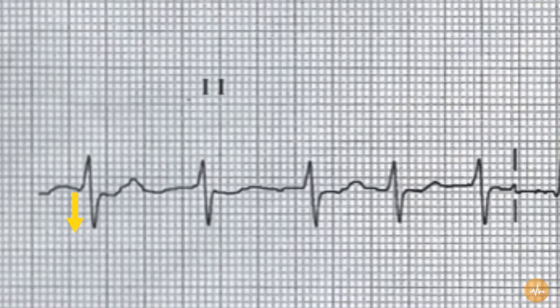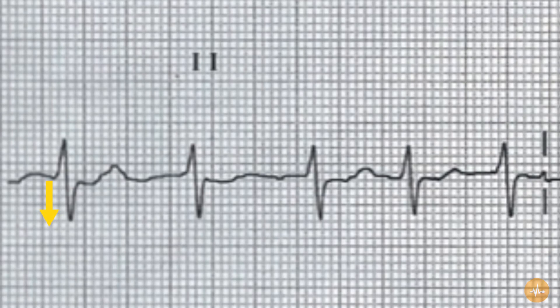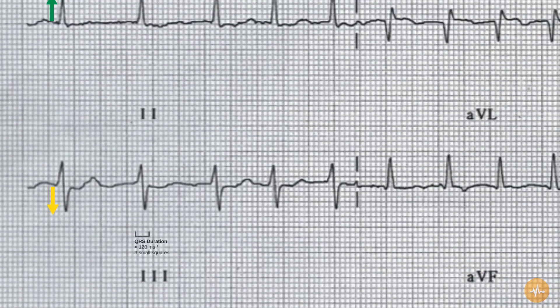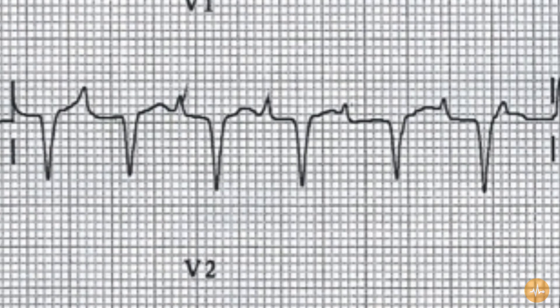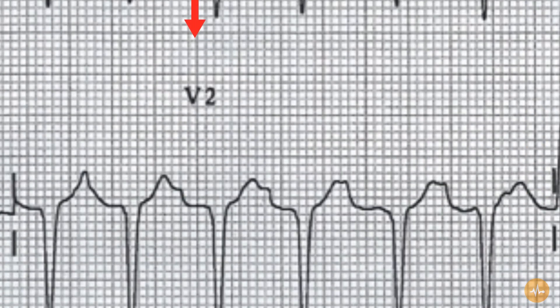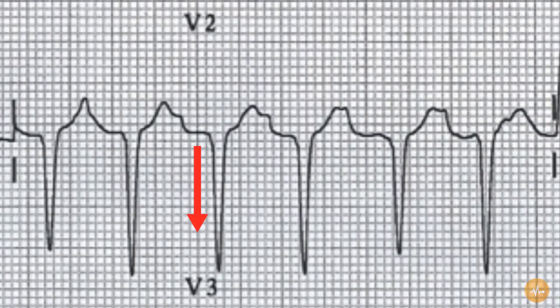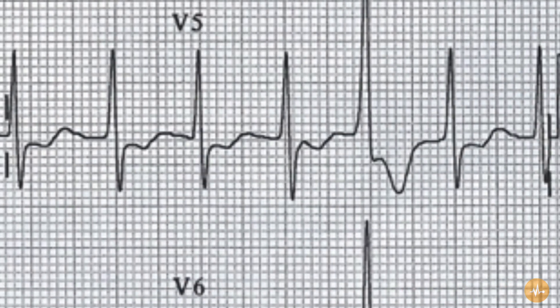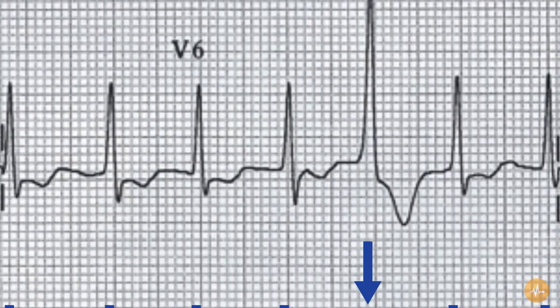The QRS duration is normal at less than 3 small squares, but there are deep pathological Q waves present in leads V1 and V2. There is ST segment depression and T wave inversion present in both leads V5 and V6.